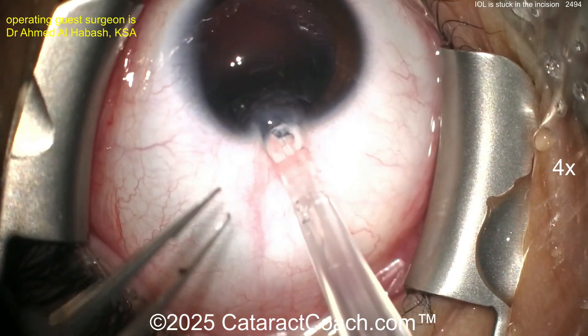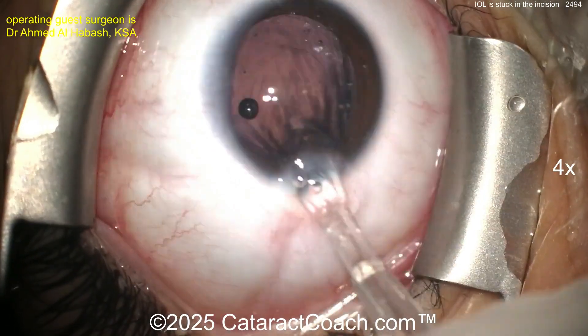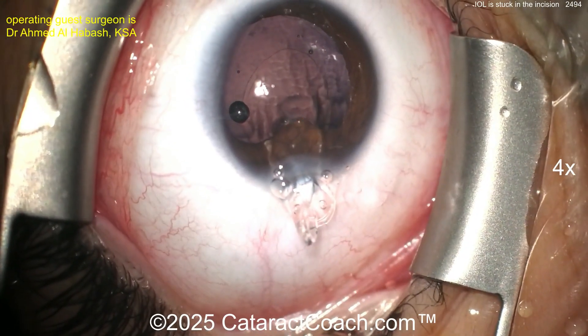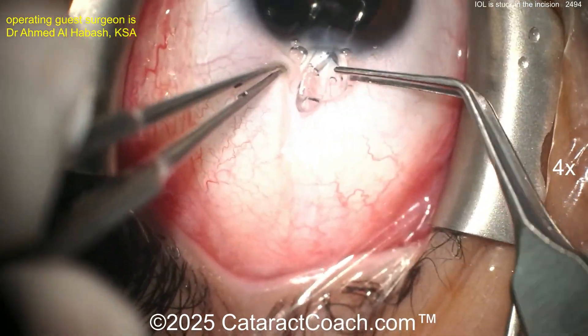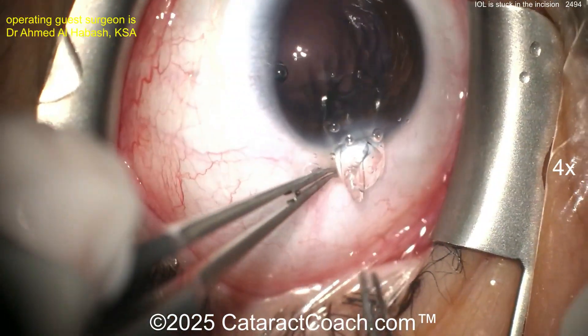You can't see what's going on because that's too tight of an incision. Now you're going to try to deliver it — try to deliver it. This is again very traumatic. Look at the number of tries here. Now what do you have? You have an IOL well stuck in the incision. It's not going to go in.